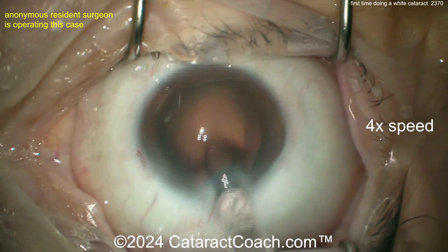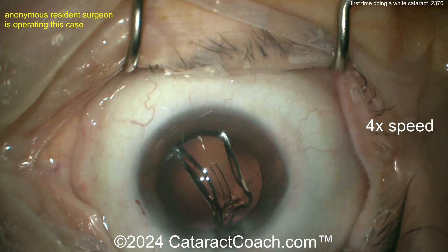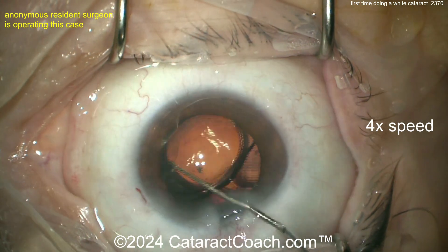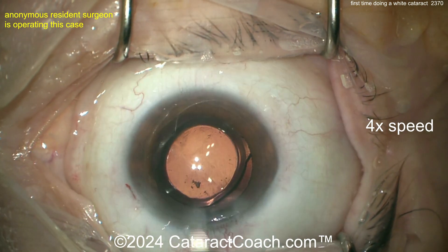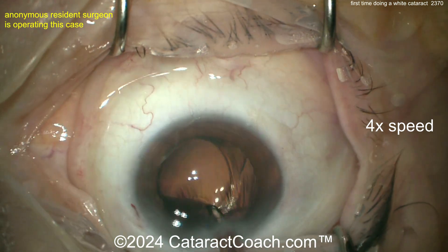Here comes the lens — probably a single-piece acrylic lens. Slowly deliver that into the bag — opening up nicely, that looks great. Make sure both haptics and the optic are in the capsular bag. Beautiful.